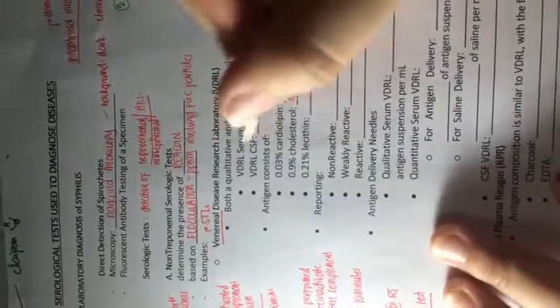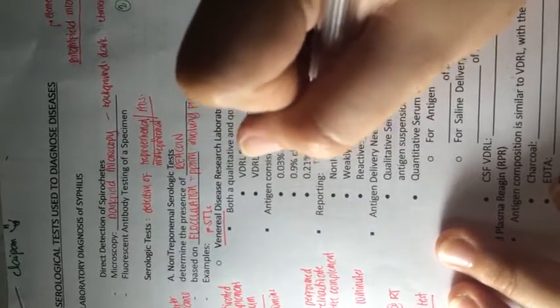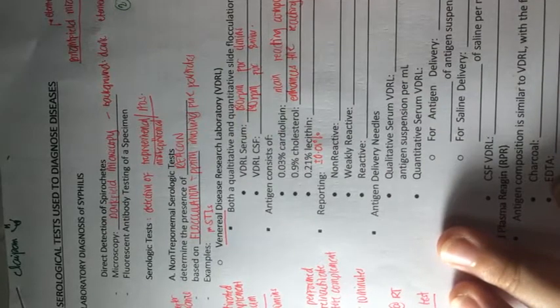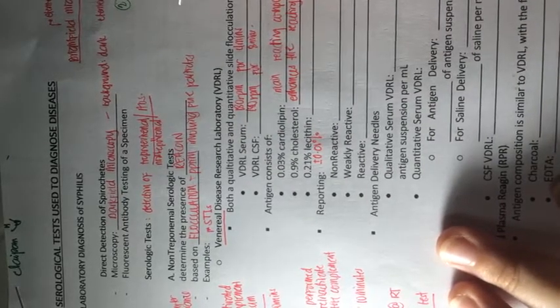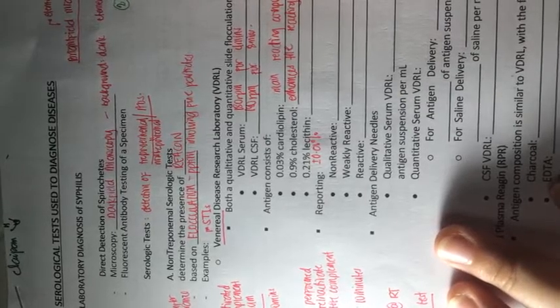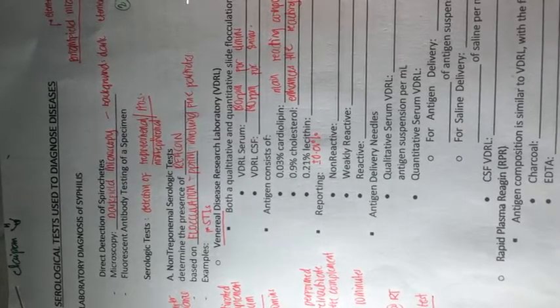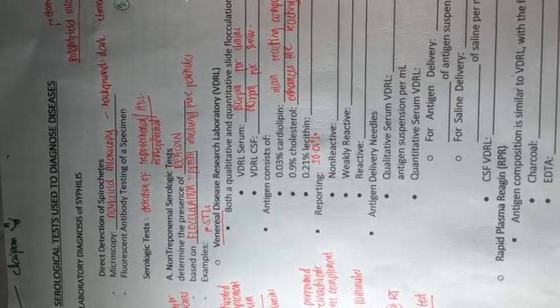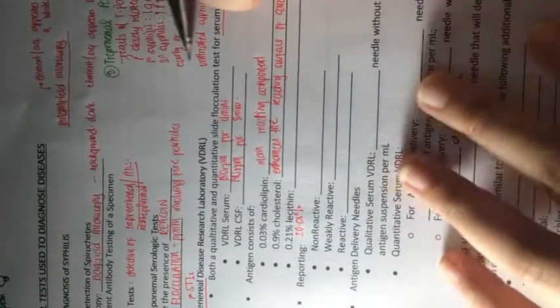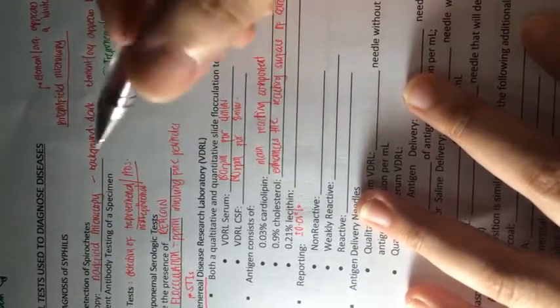Please take note, lecithin can be 0.21% plus minus 0.01%, because there have been questions using 0.20% lecithin or 0.22% lecithin, and some students would consider that a wrong statement because they say it should be 0.21, but those are actually correct because lecithin can be 0.21% plus minus 0.01%.